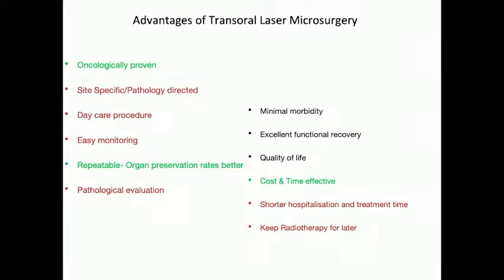So in addition to the oncological control, organ preservation and cost, since laser is a cutting tool, we get tissue for histopathological analysis. The patient knows that the cancer is removed out of the body and it's cured. It's not just burnt, and on suspicion you do a scan, there is a bit of edema, and you don't know whether the cancer has come back or not. Even though you have tools like NBI, when you give radiation, that has some fallacies in identifying and differentiating these problems.